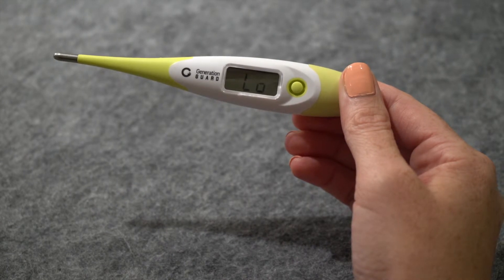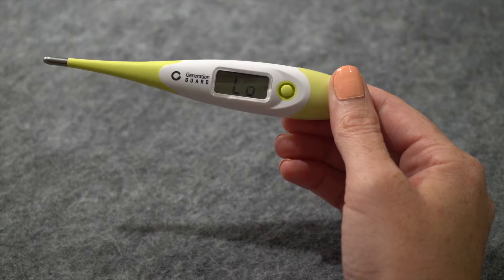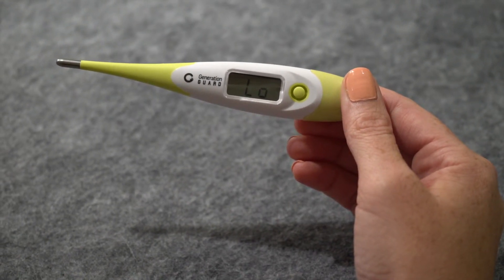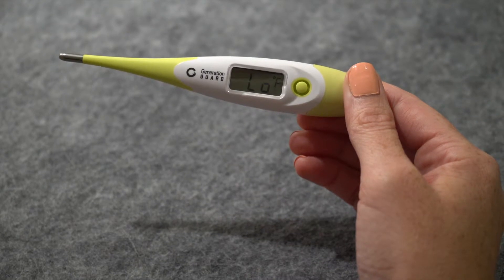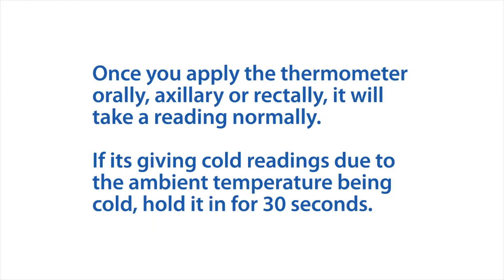When you turn the thermometer on, you will see the low symbol on screen. That low symbol is normal and does not mean the battery is low. It simply means low temperature, which is normal since the tip is exposed to the air and not in contact with any part of the body.